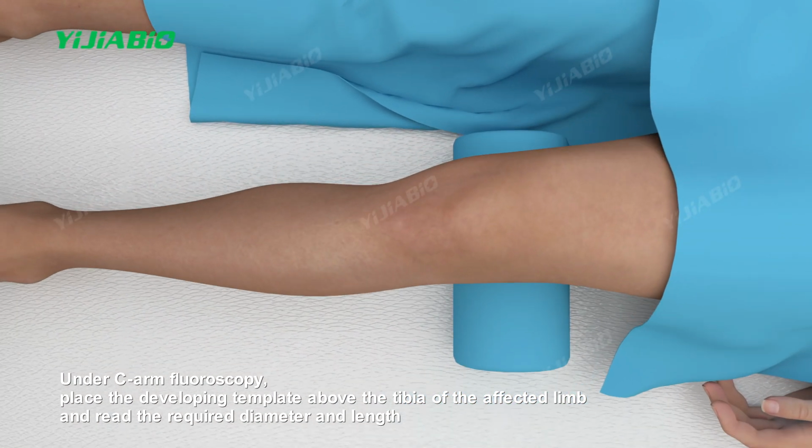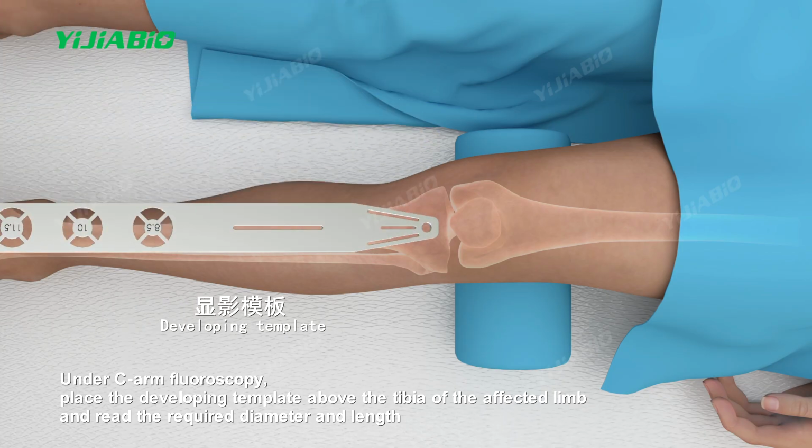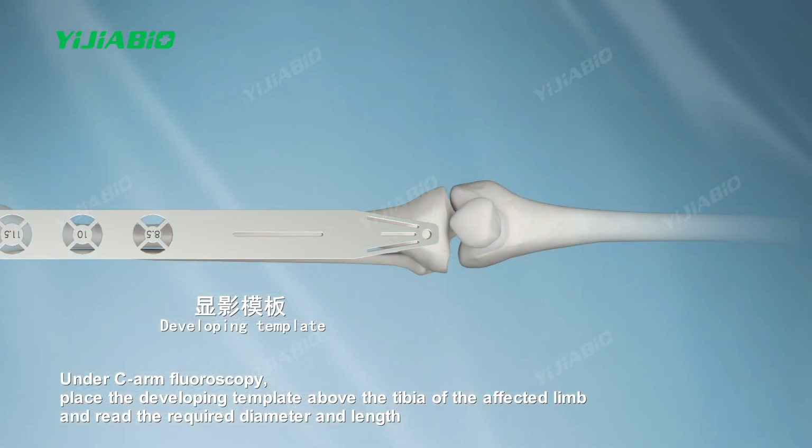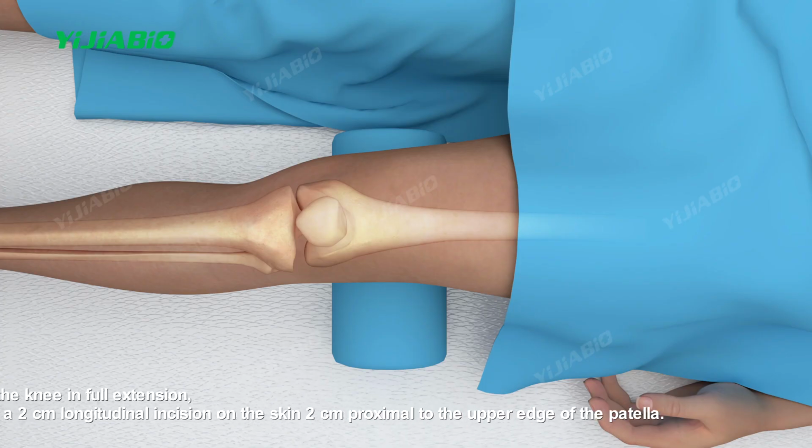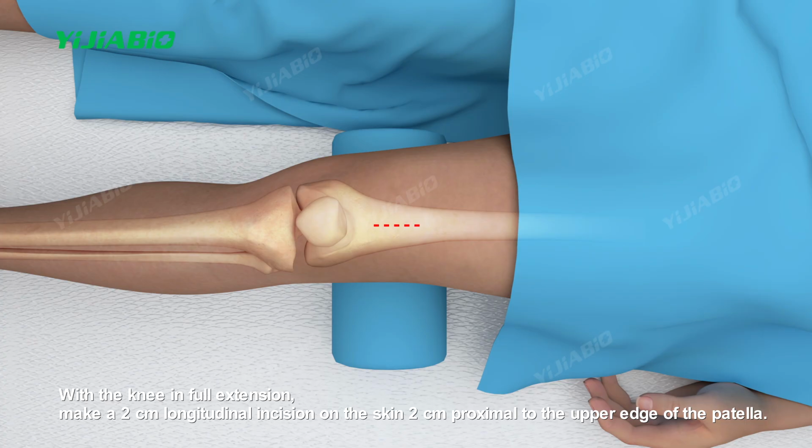Under C-arm fluoroscopy, place the developing template above the tibia of the affected limb and read the required diameter and length. Three, approach. With the knee in full extension, make a 2 cm longitudinal incision on the skin 2 cm proximal to the upper edge of the patella.